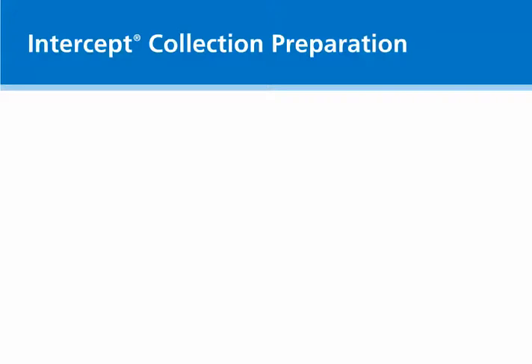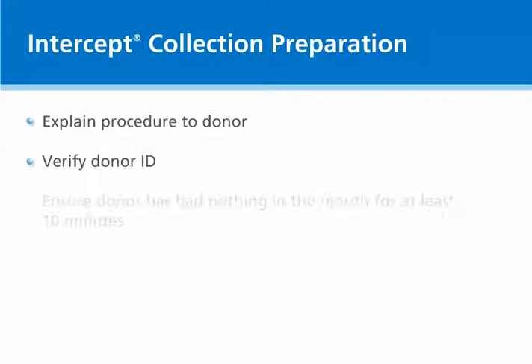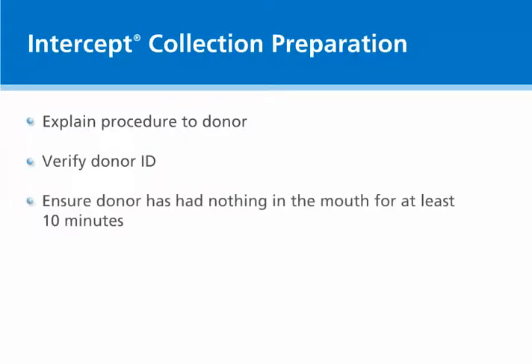Prior to collecting the sample, explain the procedure to the donor. Verify the donor's identity via a company photo ID or driver's license. In order to ensure that the sample is not compromised, make sure the donor has had nothing in the mouth for at least 10 minutes prior to collection. No eating, drinking, or chewing. If the donor has had anything in his or her mouth within the last 10 minutes, wait 10 minutes prior to beginning the collection process.